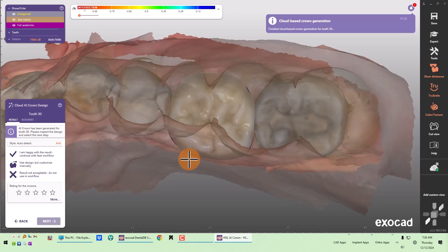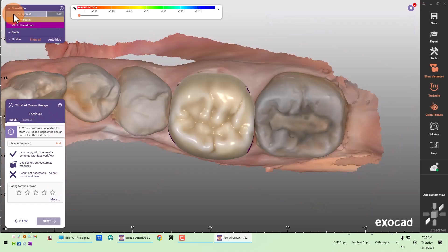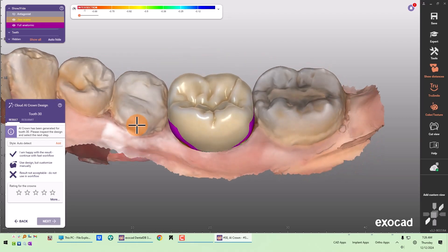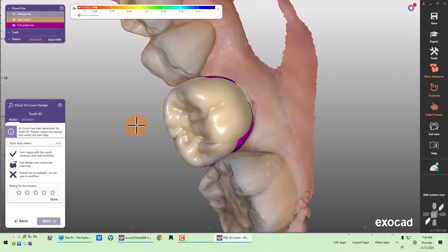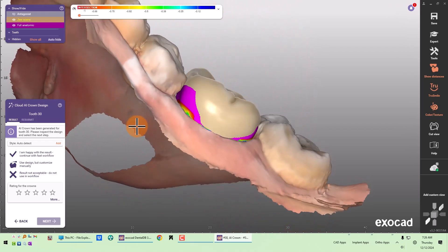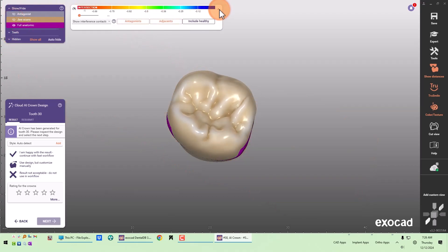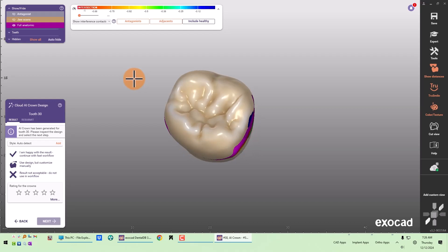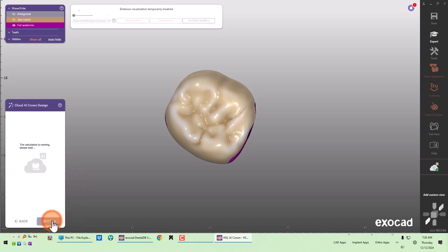Now that the crown is returned, ExoCAD is asking if we like this design. I hide the antagonist — this is the crown design that Cloud AI came up with. I take a look. It looks pretty good to me, so I click 'I'm happy with the result' and continue.